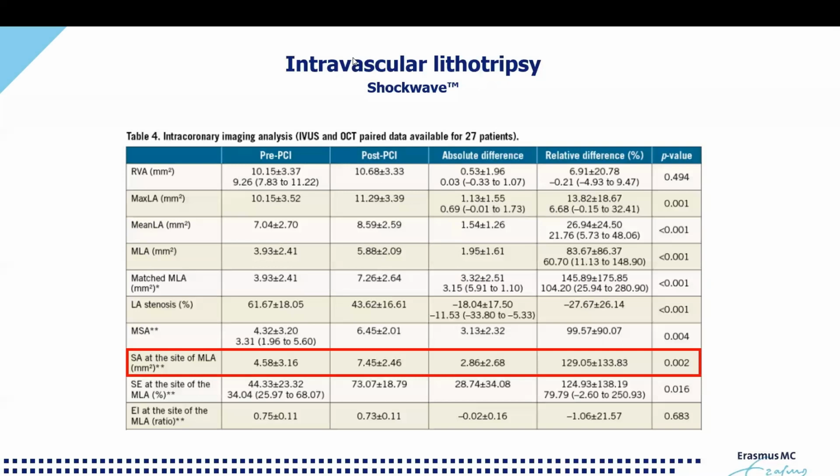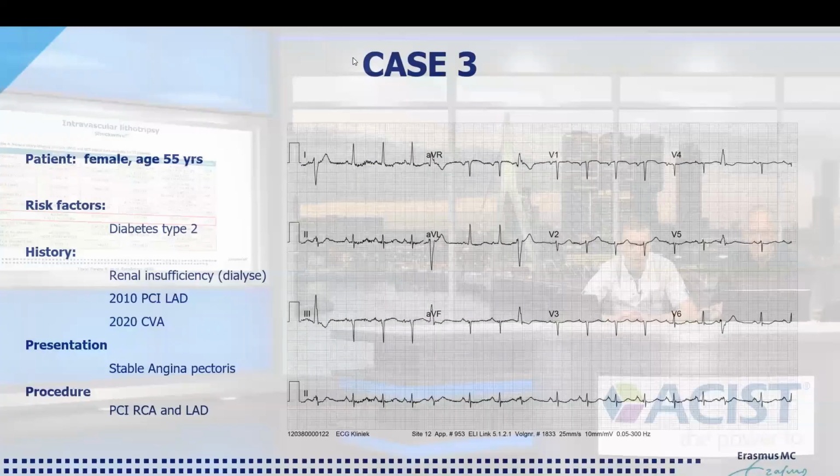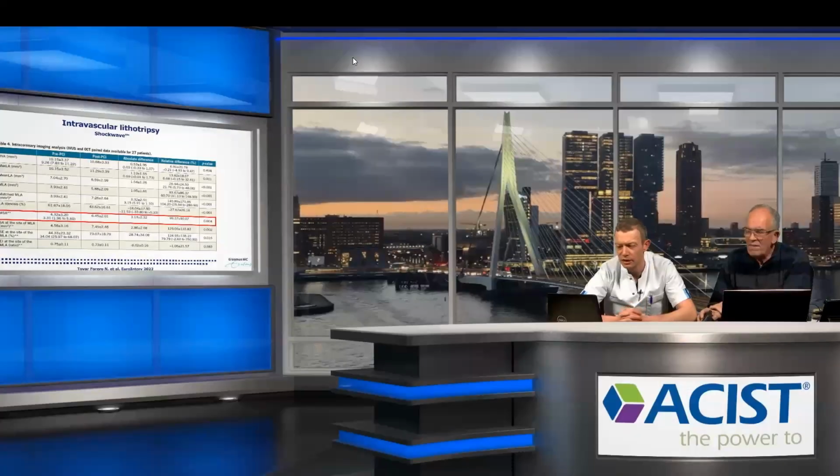And it should be said that in most of these cases, I think over 90%, post-dilatation with high-pressure non-compliant balloons was performed before the shockwave was attempted. So that said, I think there are 5 minutes more to go. There's not enough time for a final case, but there is maybe time for a final question or comment from you, Jürgen.